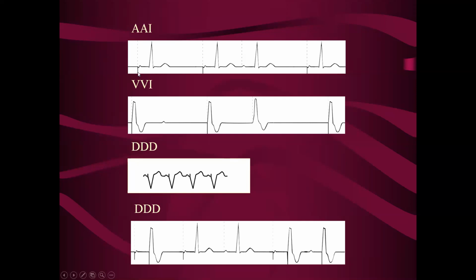So here you can see a pacing spike followed by the P wave, and then the patient is conducting, and therefore there's a QRS. And then another pacing spike, P wave, and conducting to the QRS. So these two pacing beats determine what the pacemaker rate is programmed at, what the pacemaker pacing rate is at this moment of the ECG. This is how long that low rate interval is.